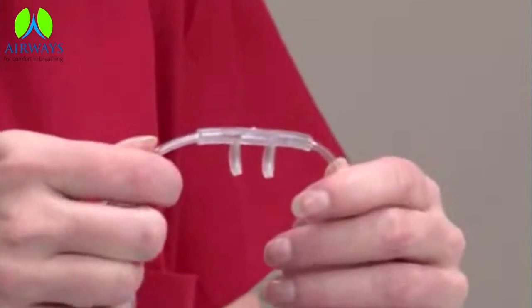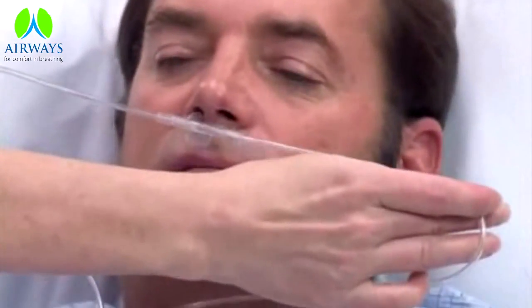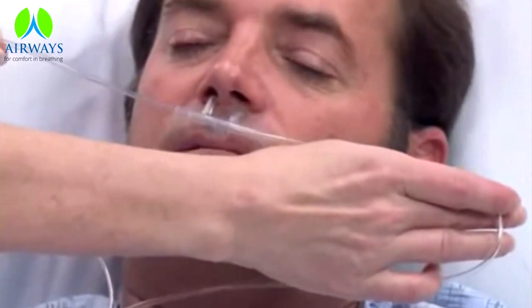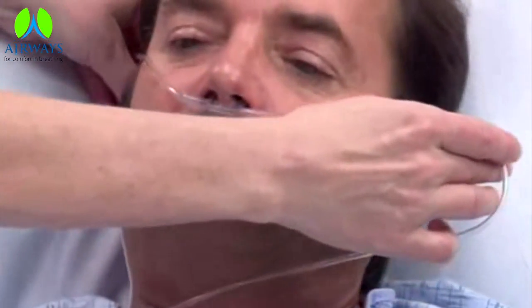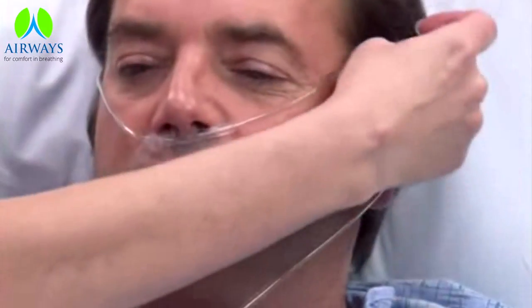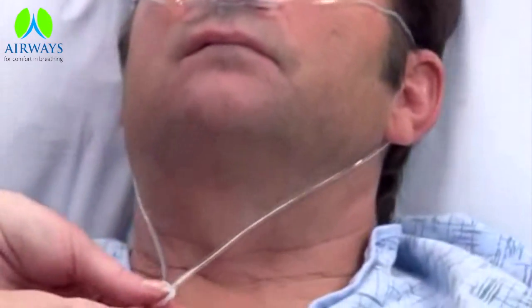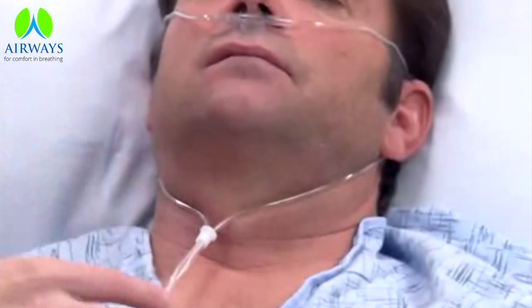Nasal cannula contains two prongs with oxygen supply tubing. Insert the two prongs into the patient's nostrils. Loop the tubing behind the ears of the patient, ensuring no pressure on the tubing. Adjust the toggle to make sure of a proper fitting.